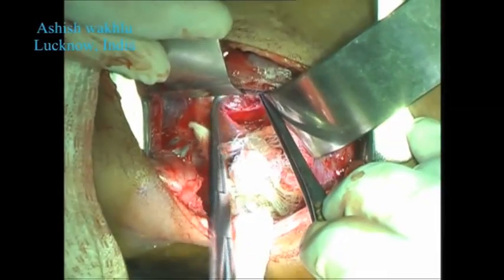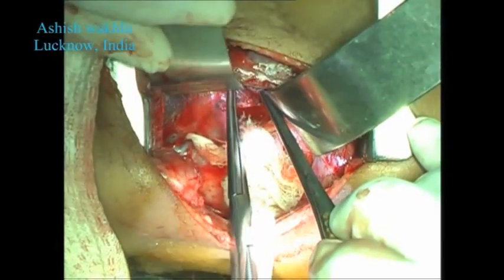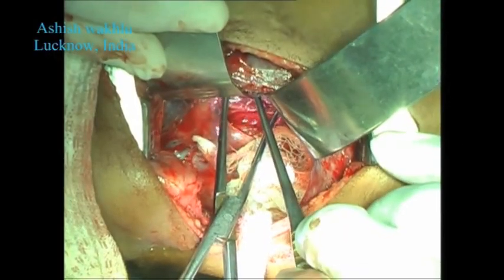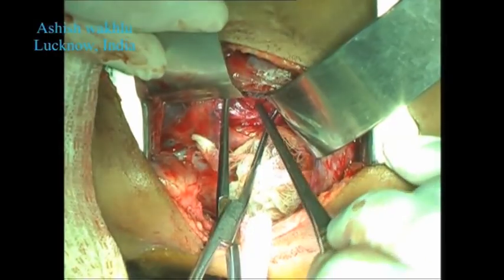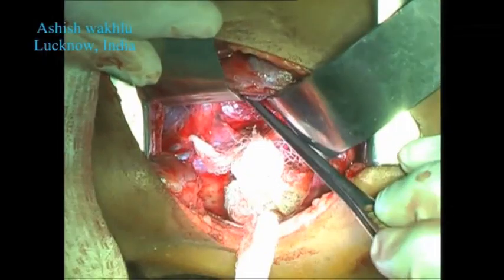Clearly, a degree of patience is required for this step of the operation because there is no significant length of the right bronchus available to be identified, and it is purely by feel that the tracheal bifurcation can be dissected clear.